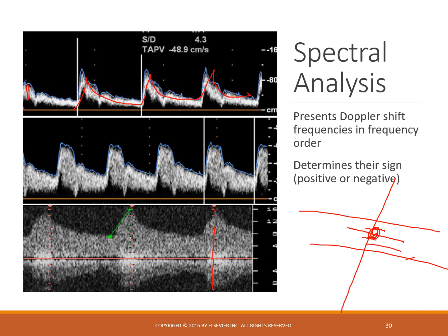This is probably a very turbulent area, with all kinds of velocities going on at this one moment in time. As it does that, it draws these lines each time it gets a sample, and overall those lines create the ultimate pattern and give us our spectral analysis.